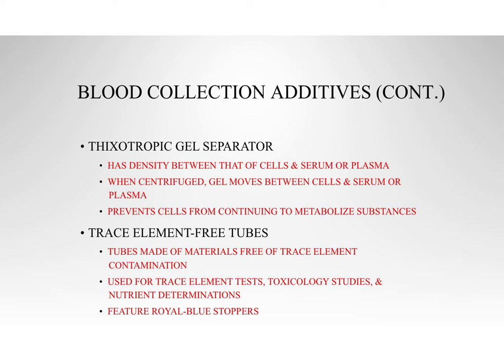And then if we have a tube that we've drawn it out that leaches out trace amounts of lead, we may have this really terrible treatment, and unnecessary treatments are not fun anyway, and it's not okay. So we would not want to draw their blood in a tube that could maybe leach out that element, and then they get a false positive, basically.